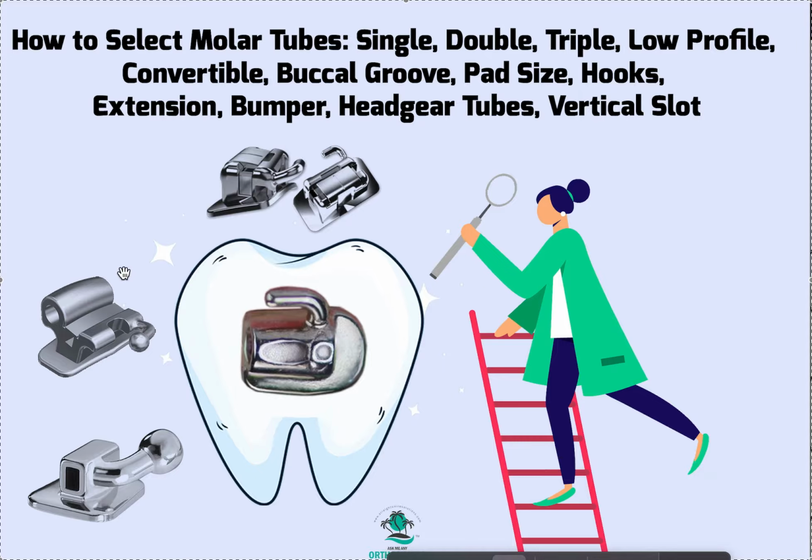This auxiliary headgear tube is for headgear. None of you should be using it, and I don't mean face mask headgear, but headgear like from the 50s, 60s, and 70s that goes around the neck and the head. I don't use that at all. Why would I want to restrict the maxilla? If I have that problem, then I should be advancing the mandible, right? For airway, it makes zero sense. I definitely did a lot of those before, but once I started learning more about airway, I said no, we're not doing that anymore.